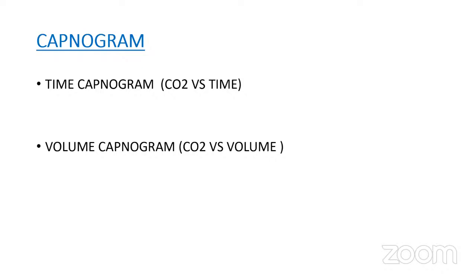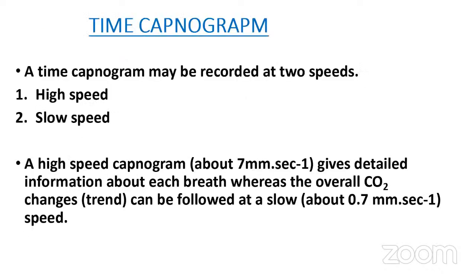So we have the time capnogram and the volume capnogram, that is CO2 versus time and CO2 versus volume. The time capnogram can be recorded at 2 speeds, that is high speed and low speed.